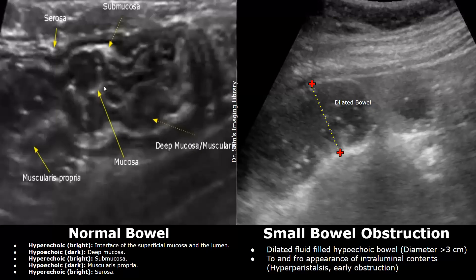In the image on the right we have another dilated fluid-filled hypoechoic bowel with a diameter greater than three centimeters. It had a to-and-fro appearance of intraluminal contents seen on real-time imaging, indicating hyperperistalsis — often seen in early obstruction.